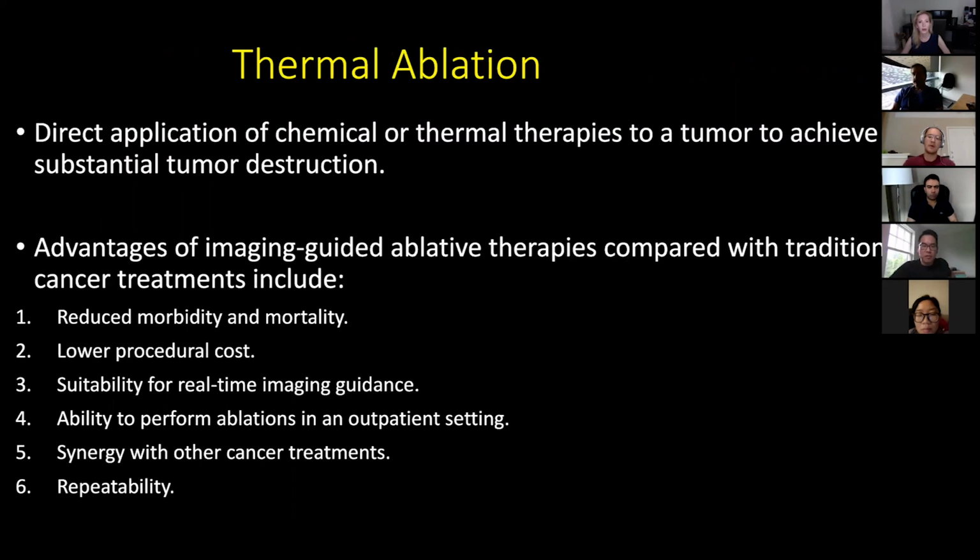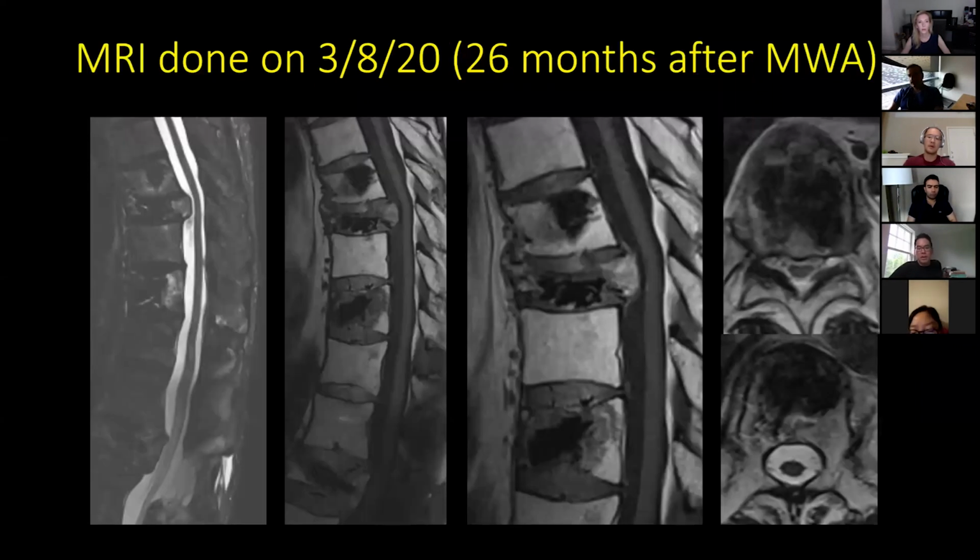Majid, I have a question for you. With regards to that technique, is there a specific time point when you see radiographic response from the ablation? Usually in the studies that we did, I scanned our patients at 4 weeks. Most of them are cancer patients, so they have their scans at a particular interval by their oncologist.